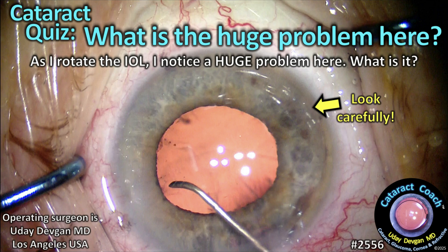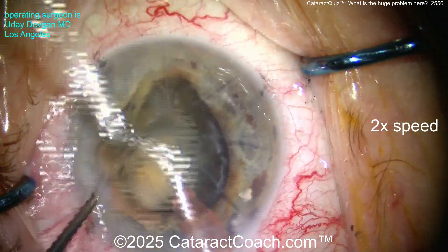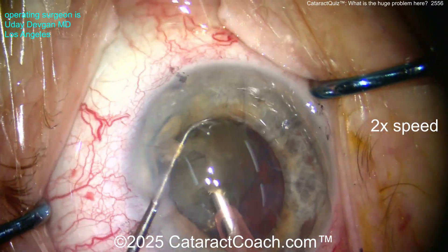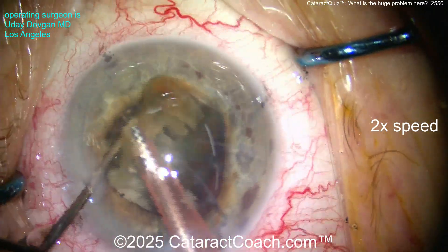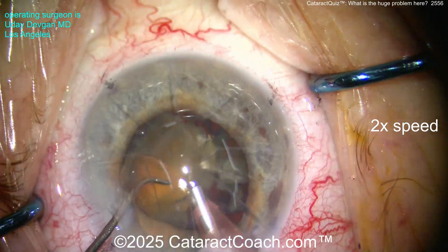Cataractcoach.com cataract quiz — what is the huge problem here? Look carefully at this picture because as I rotate this lens, I know there's a huge problem. The patient has a relatively dense nucleus. You can see there are eight radial keratotomy incisions in the cornea, so we're very careful to place our phaco and other instruments between those RK cuts — we never want to intersect the RK cuts.